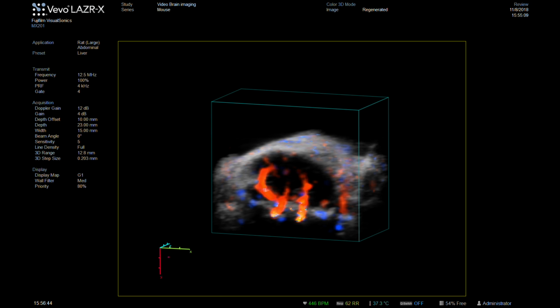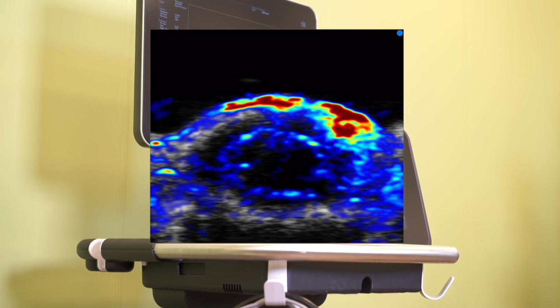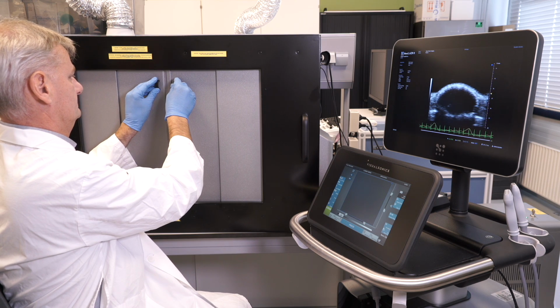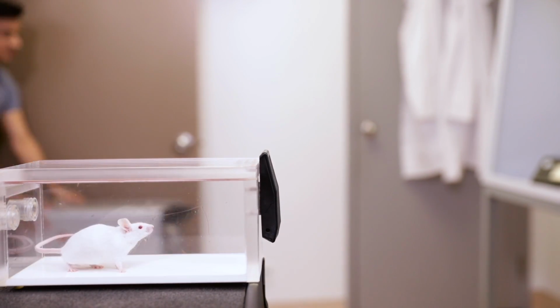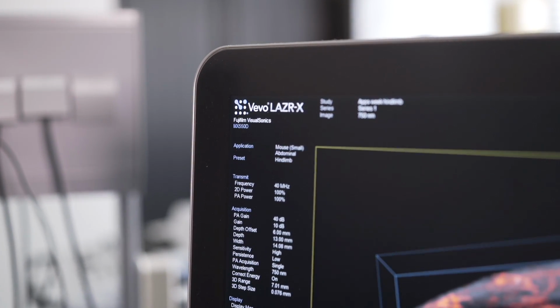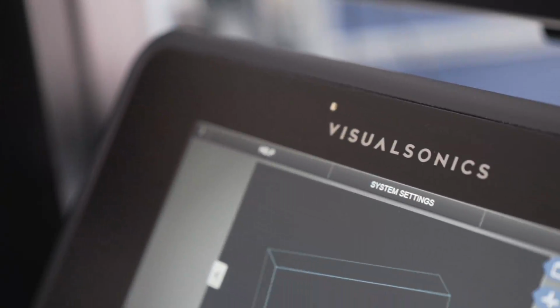So, photoacoustic imaging and ultrasound allows optical signals to be detected, resulting in exceptionally high resolution and quantification. The examination is quick, it doesn't use any contrast agents, and is non-invasive, so you don't have to sacrifice the animal. Other research applications include investigations into blood-brain barrier disruption and drug delivery across the blood-brain barrier using dyes and nanoparticles combined with focused ultrasound disruption.